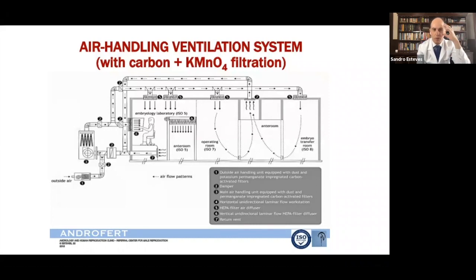But I consider it a well-designed system, in which we include VOC filtration with activated carbon, permanganate, zeolite, and silica. We also have HEPA filters as the terminal filters, and obviously pre-filters to trap the large dust. Having the terminal filters as HEPA filters, we found it very nice.